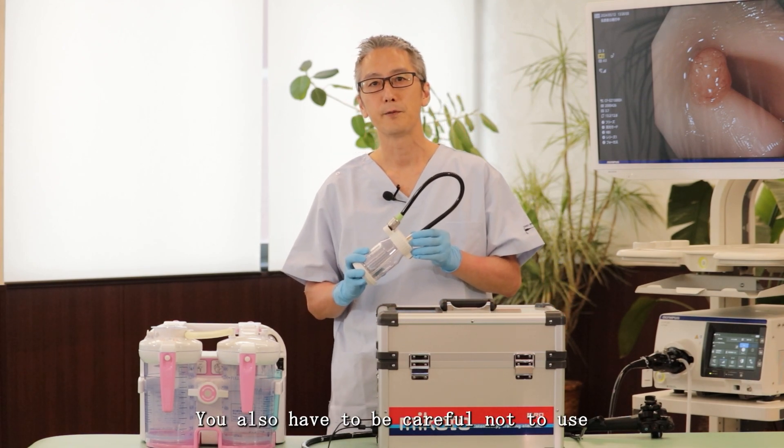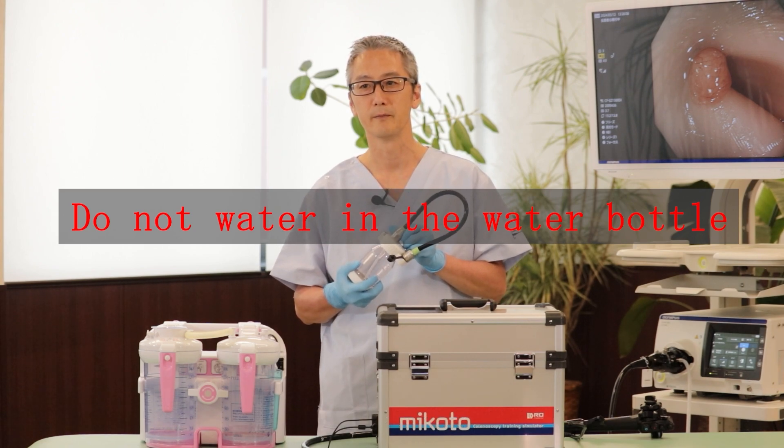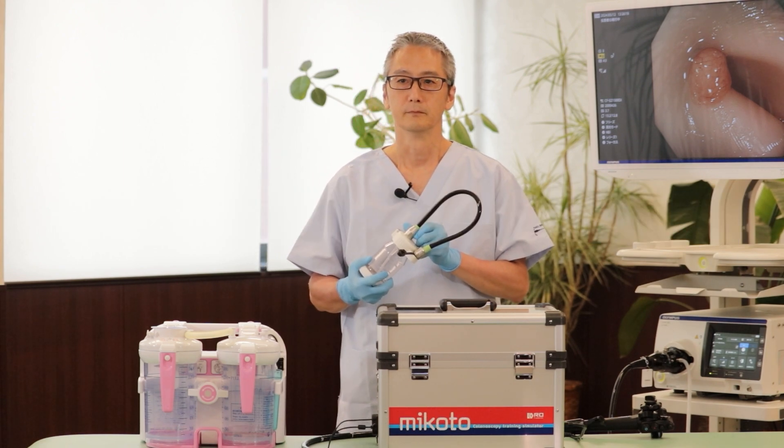You also have to be careful not to use water in the irrigation tank, because water does not mix with oil lubrication.